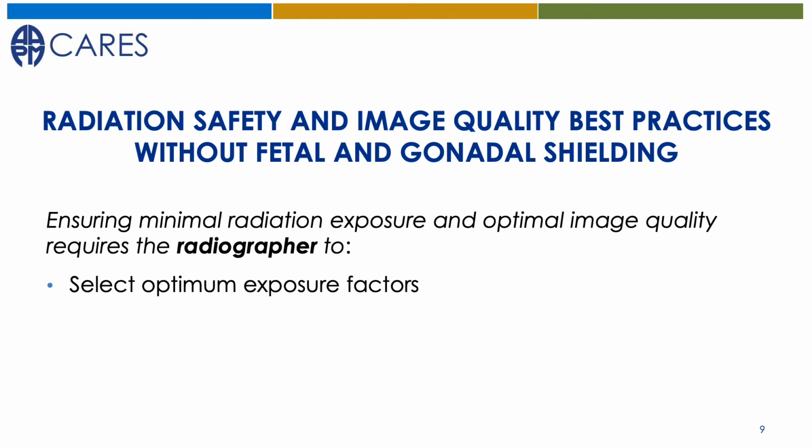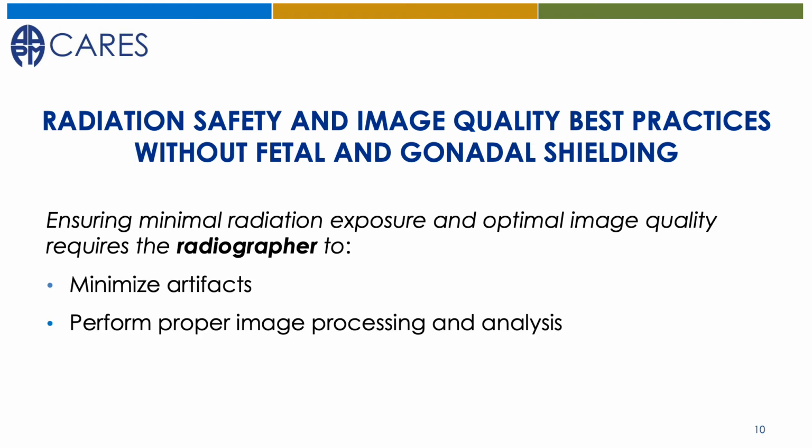Appropriate MAS can only be evaluated by correlation with deviation or exposure indices following image processing. Radiographers must ensure no artifacts are within the image. This includes requesting patients to remove any clothing or other items within the exposure field that might create an artifact on the image. In instances when the patient is unable to communicate or comply with instructions, the radiographer must check for potential artifacts and remove them before making the radiographic exposure.